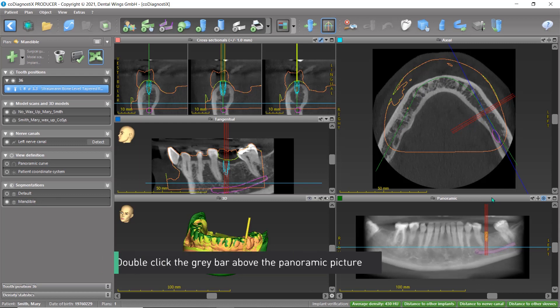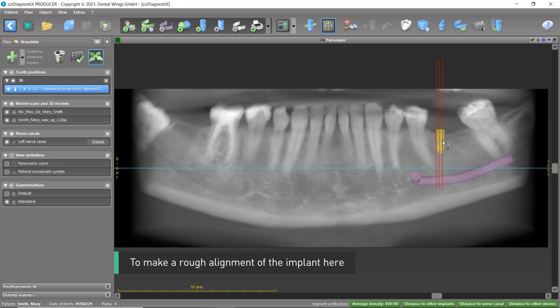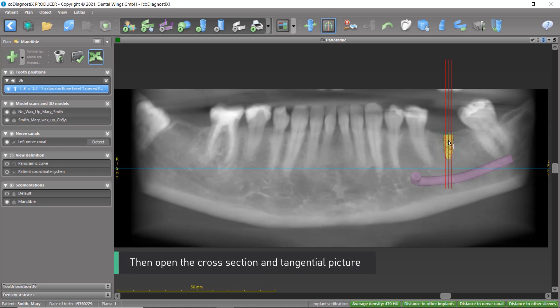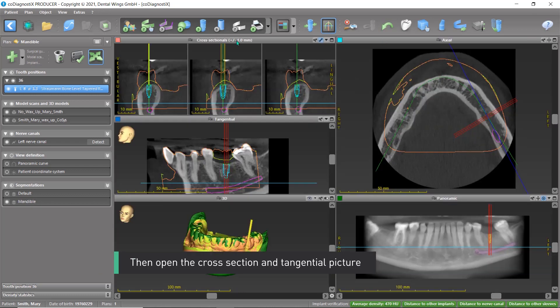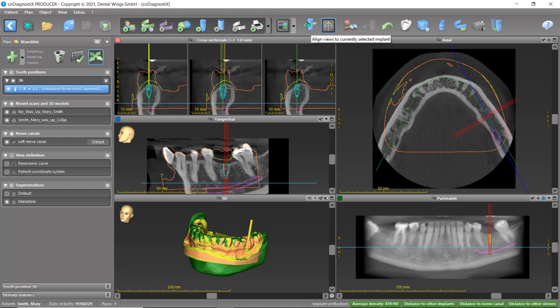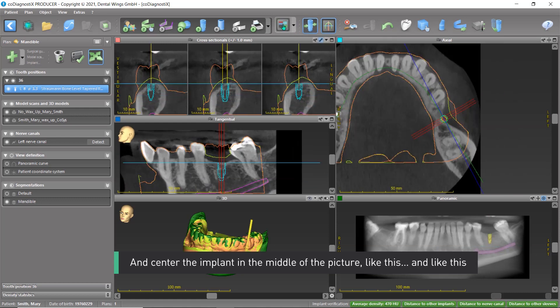Double-click the gray bar above the panoramic picture to make a rough alignment of the implant. Then open the cross-section and tangential picture and center the implant in the middle of the picture — like this, and like this.